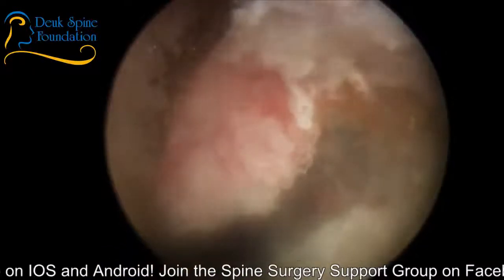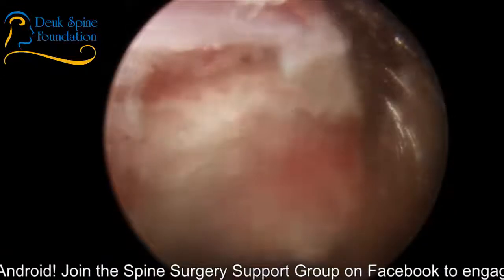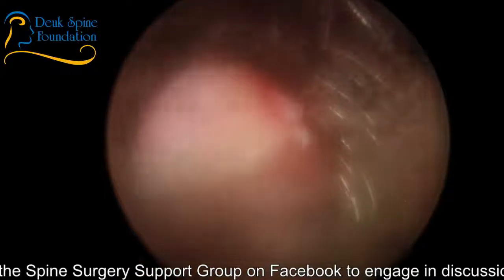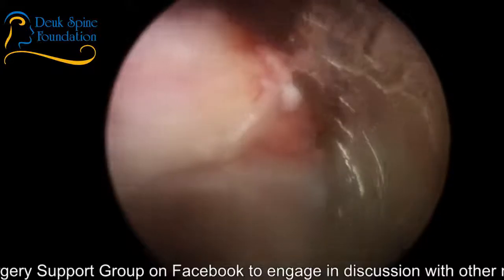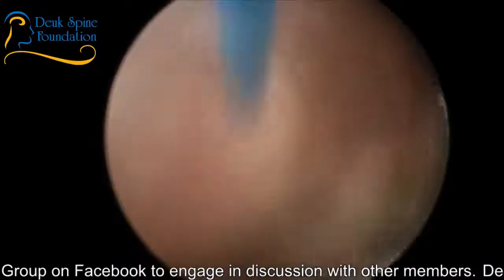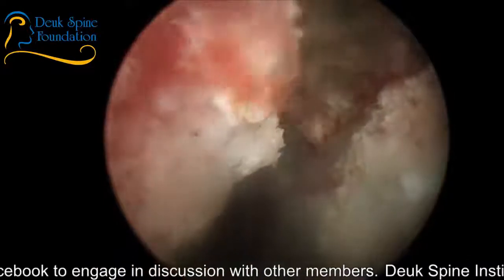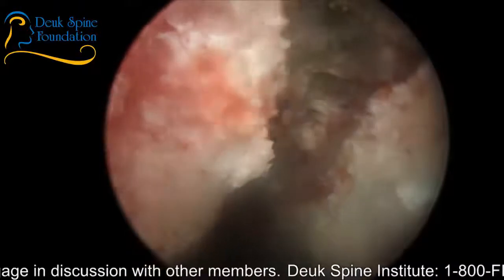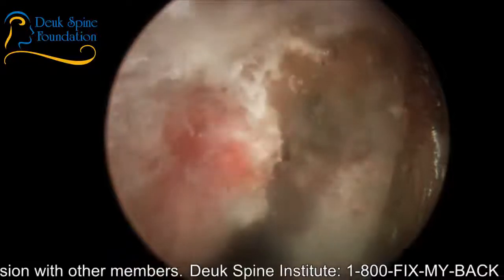There's a bone spur right there, but it's not pushing on the nerve. It's not bothering anybody. We're leaving it alone. There's another nerve right here in the foramen. You see it, the white thing right there? That's the nerve root. The dorsal root ganglion is right there. So this herniation was just below it. That, again, that bone spur, we're going to leave it alone because it's just going to cause bleeding. You see the bleeding coming from the bone spur? I was telling you about it earlier. They do bleed. So we leave them alone unless we have to take them out.